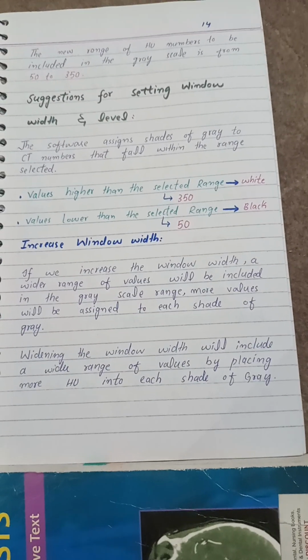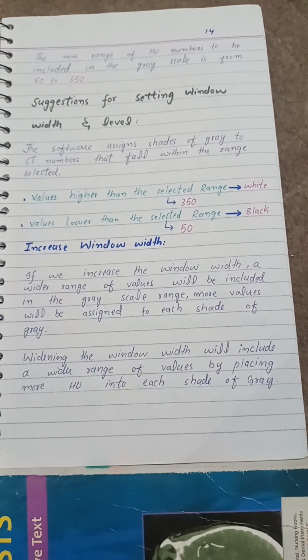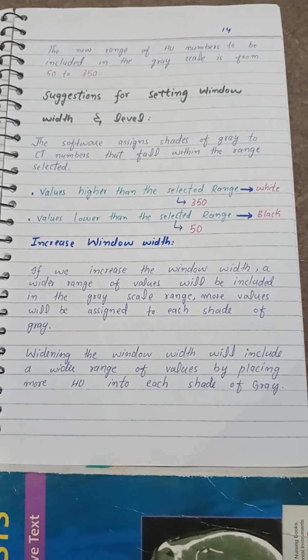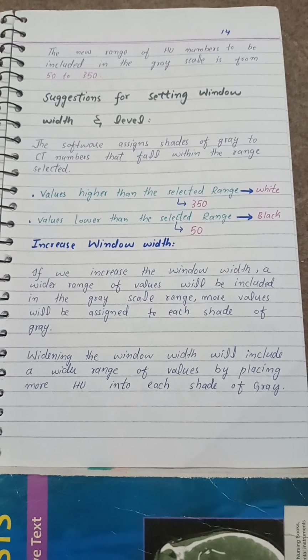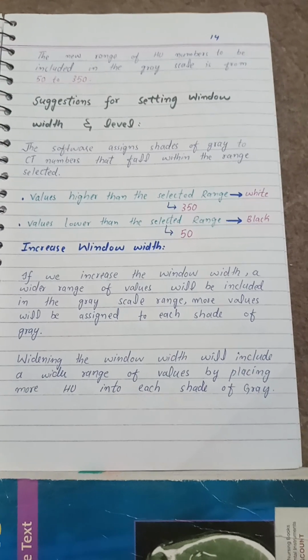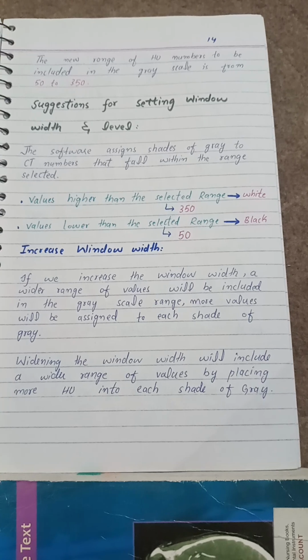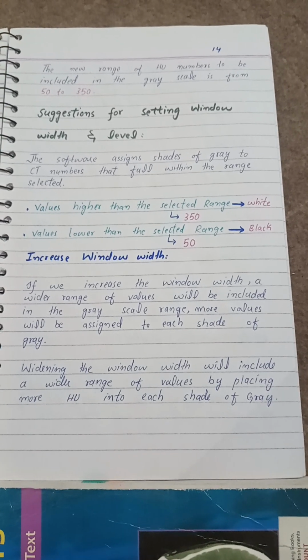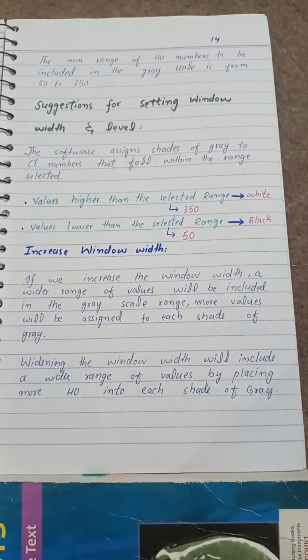Increase window width: if we increase the window width, a wider range of values will be included. In the grayscale range, more values will be assigned to each shade of gray. Widening the window width will include a wider range of values by placing more Hounsfield units into each shade of gray.